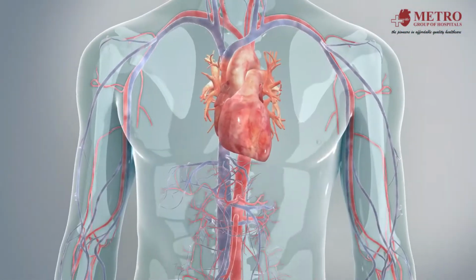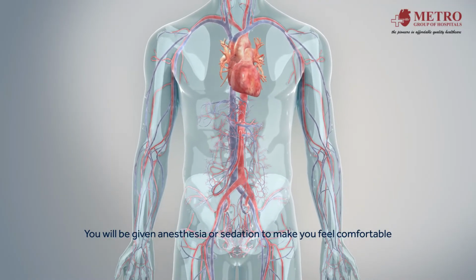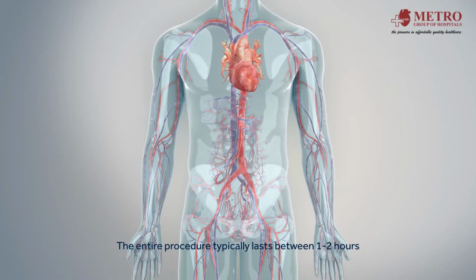Before the procedure begins, you will be given anesthesia or sedation to make you comfortable. The entire procedure typically lasts between 1 to 2 hours.